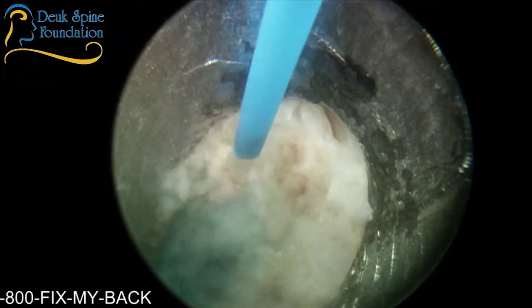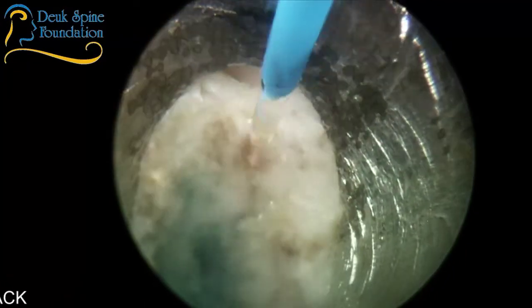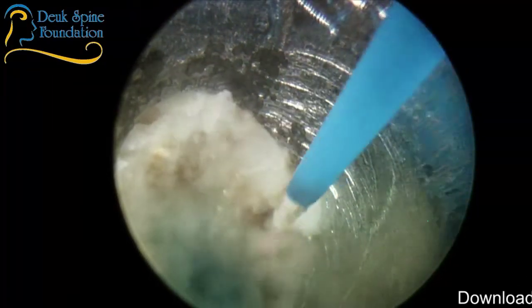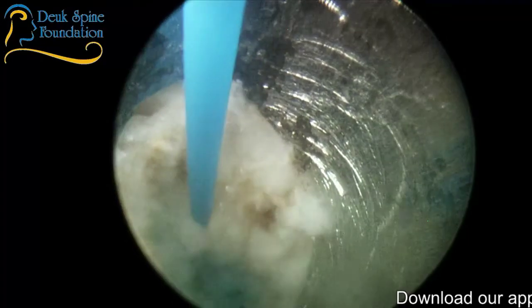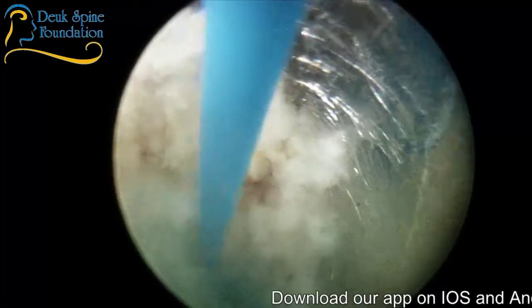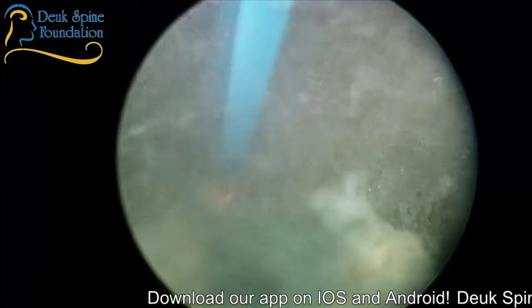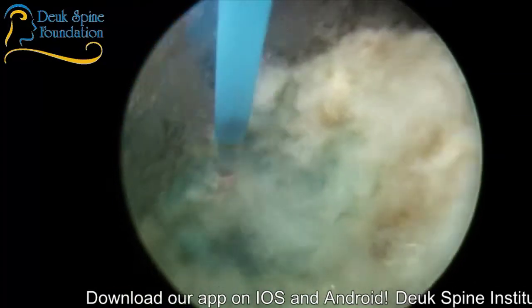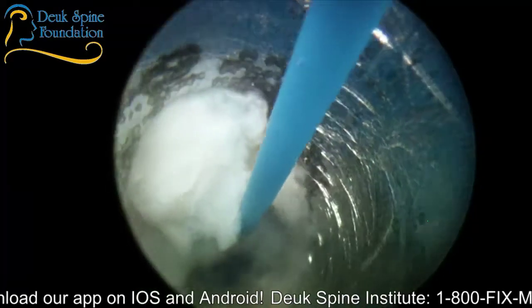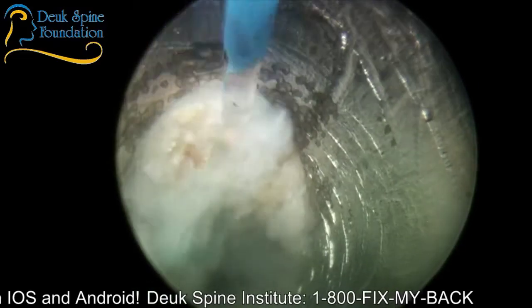This is nice because if we had to do a fusion here at L5-S1, which we could be doing, by the way, she didn't want a fusion. We would have had to take the other screws and rods out, at least the rods and the set screws, because we would have to extend the rods further south and put a cage in this disc space as well. So by having the laser, she avoided another fusion surgery. That's part of the herniation right there. You can see the scar tissue.